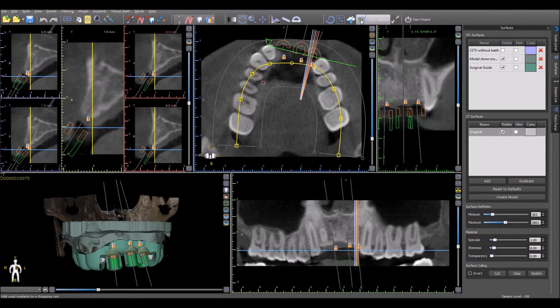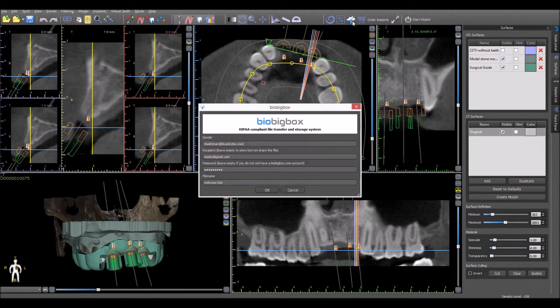From within Blue Sky Plan, simply click on the icon to upload to BioBigBox — the arrow and the cloud icon. Enter your email address as the sender and enter the email address of the recipient in the second box. In the third box, enter your BioBigBox password. Being a registered user at BioBigBox has the advantage of not having to confirm your email address each time you send a file.